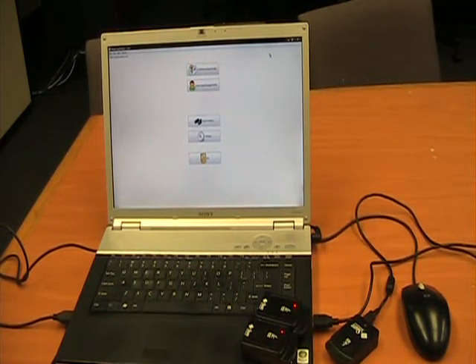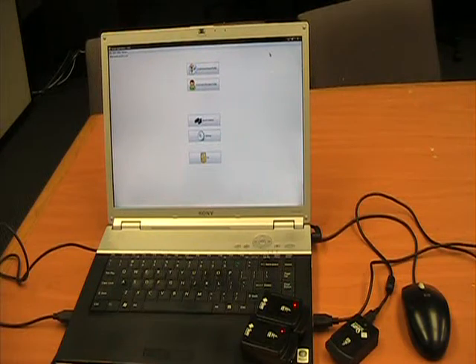Hello and welcome to this video demonstration of the rehab application using the SunSPOT.